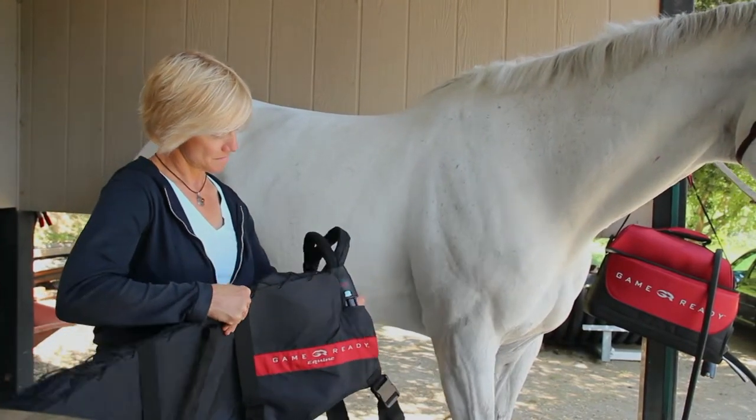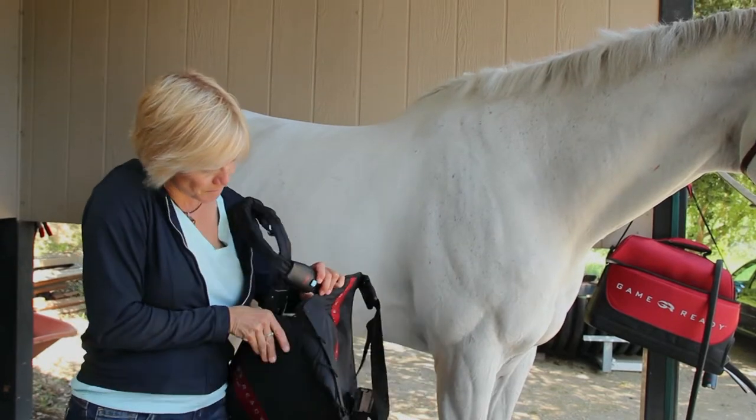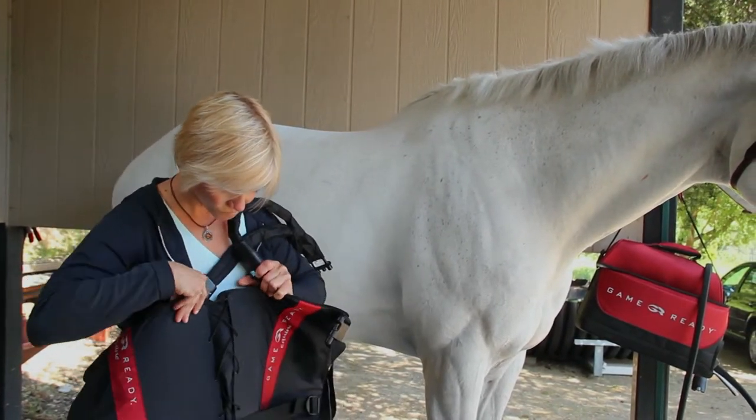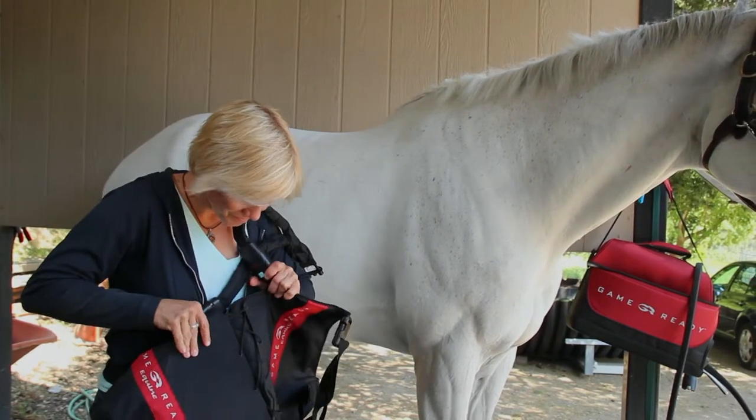Finally, adjustable lacing at the spine of the backwrap allows you to tailor the fit to the top line of your horse. Optimal pressure for the backwrap is medium pressure.